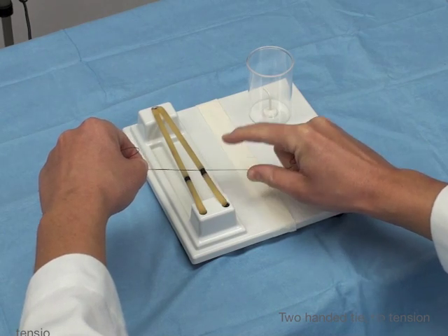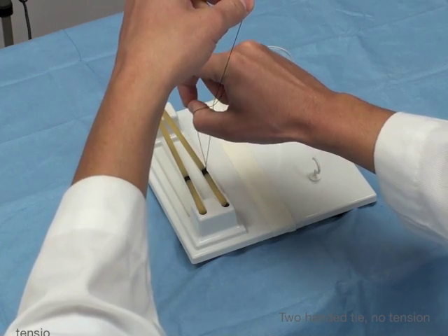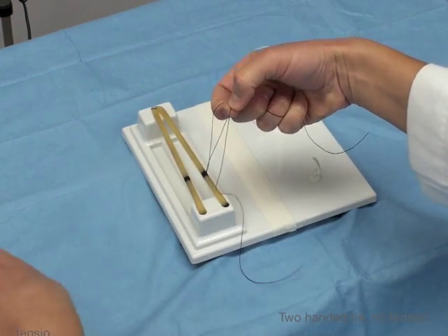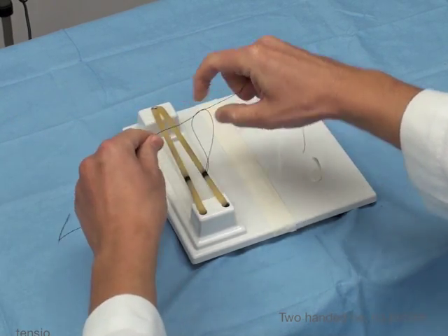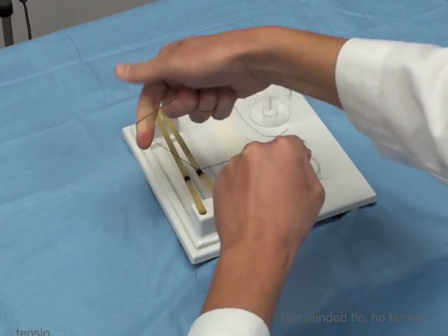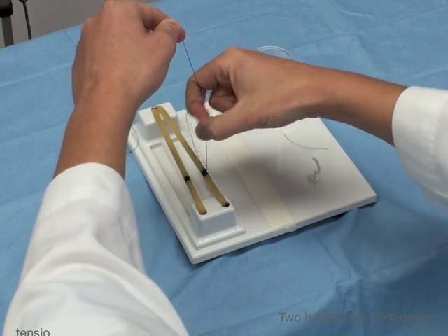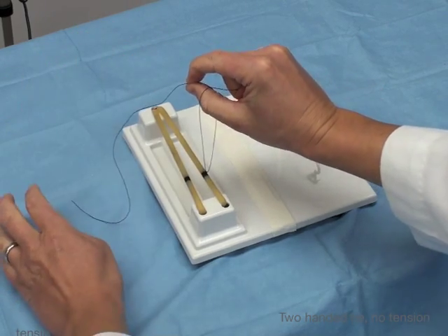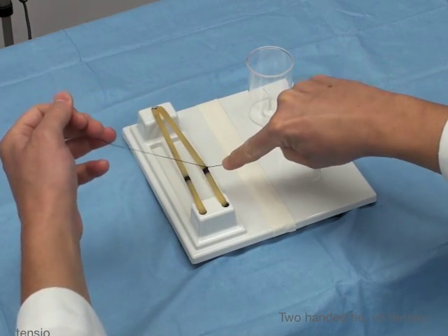The next throw: hook with the thumb, bring it to midline, make a cross, perfect sign, push it through, pass it off. Now you can see where this is crossed here, so I have to cross my hands to make it lie flat or square. That sets myself up for the pistol grip. Cross, perfect sign, push it through, grasp it, push it back through, and then you lie it down flat.